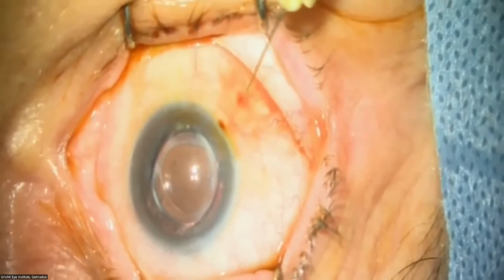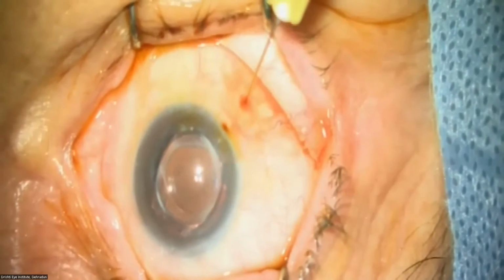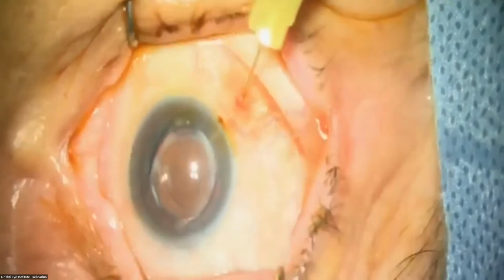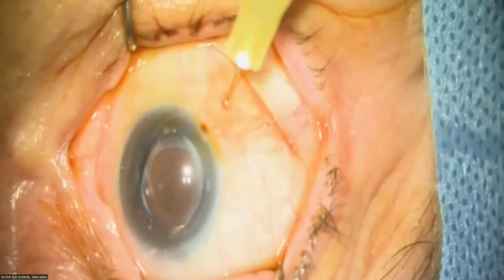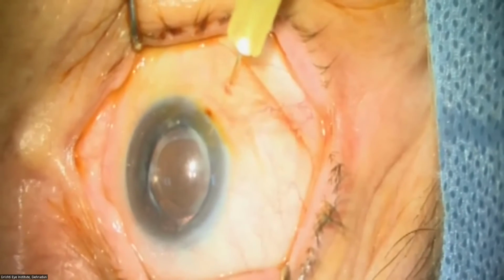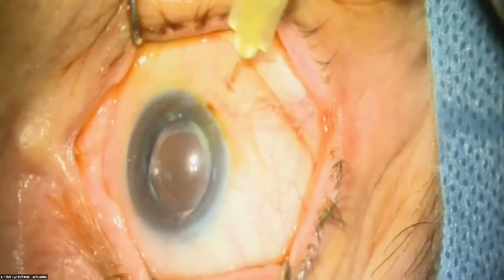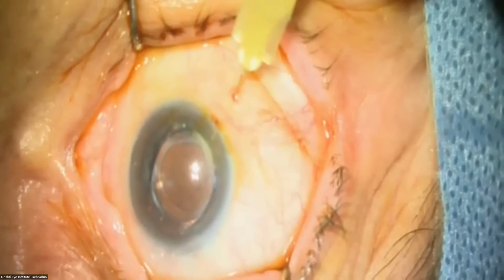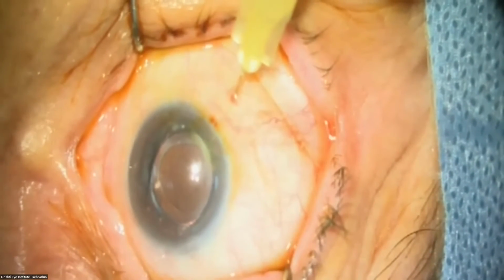And then with the 30 gauge needle, I will just enter at 3 millimeters. And once I'm in, I don't really need to see the needle inside, because with more than about 2/3 of the needle in, I know that I'm inside the vitreous cavity. And then I will inject 0.05 ml.